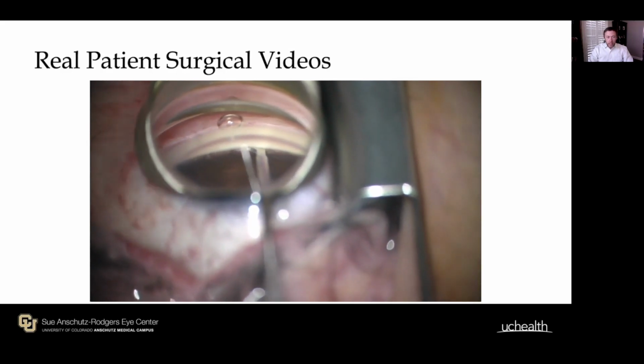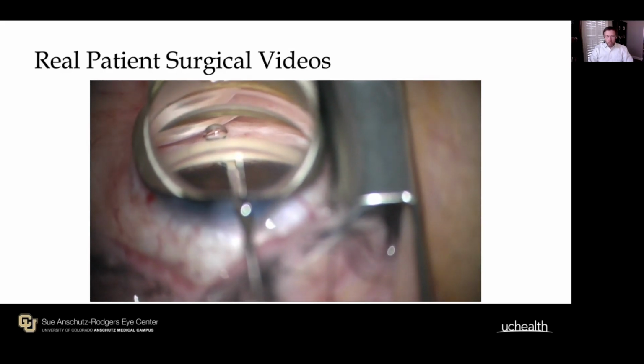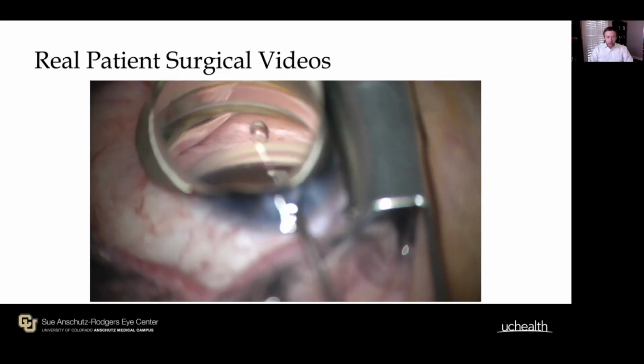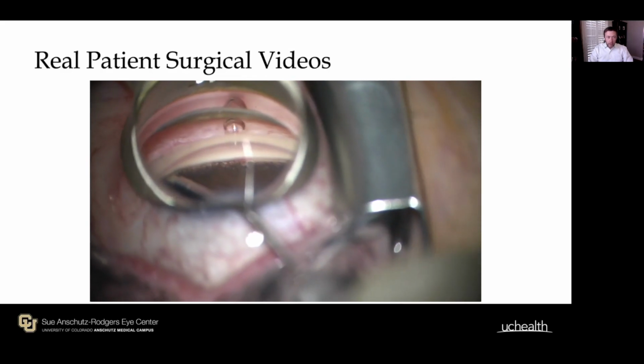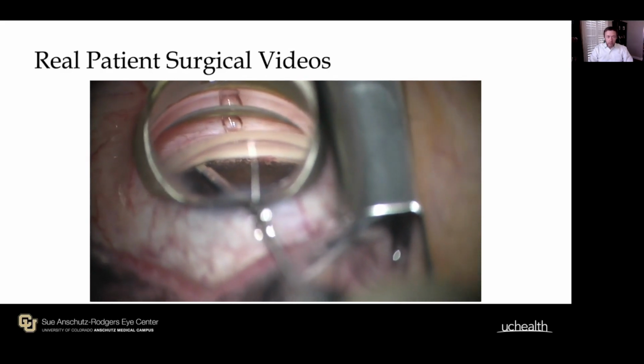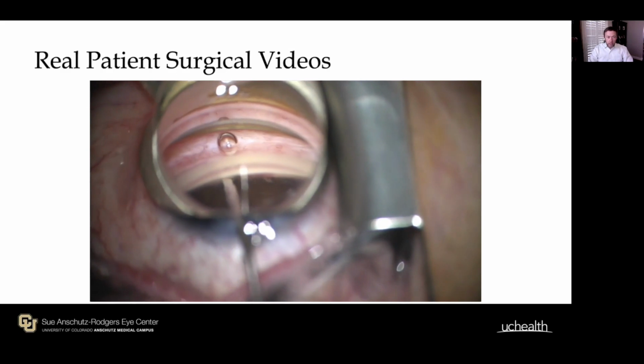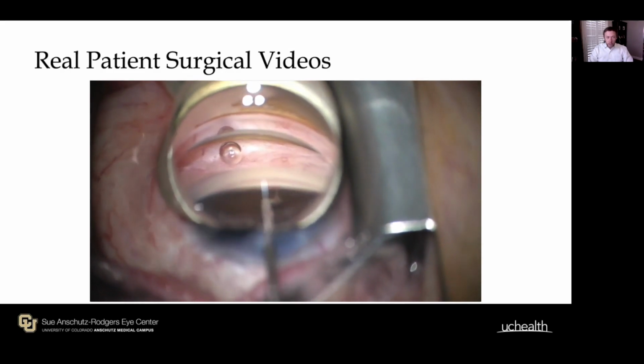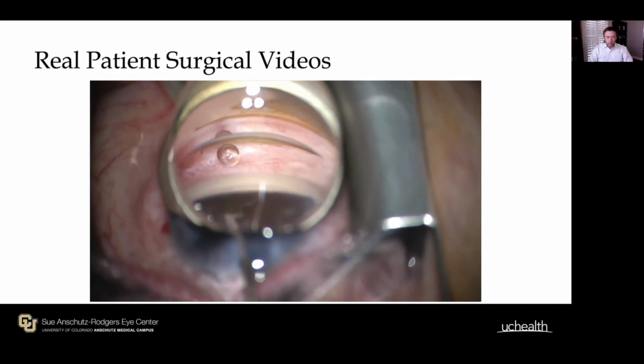And then finally, the outside in technique. So here we're starting first with a forehand motion from the right to the left of our view. We're going to stop here, reverse the blade to a backhand motion, and start from the left and head to the right until we meet where we finish with our initial incision. And this again should give us a nice free-floating strip of TM, which you can see coming off the tip of the blade there.